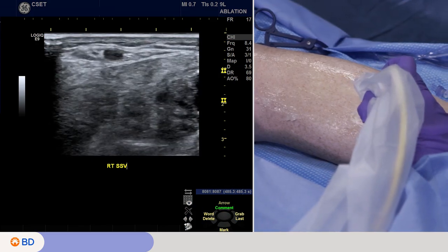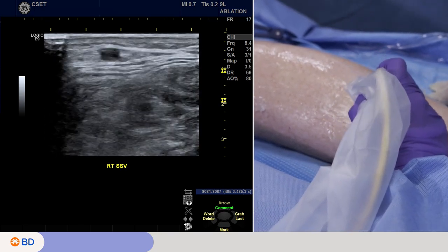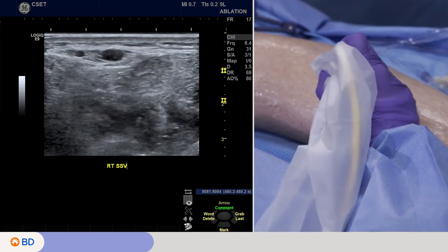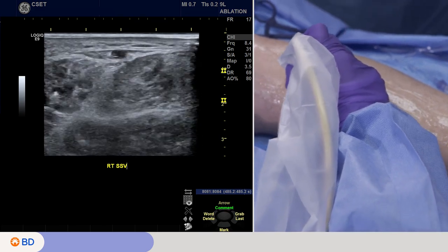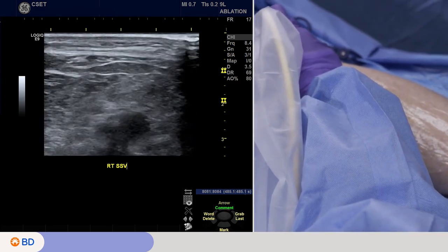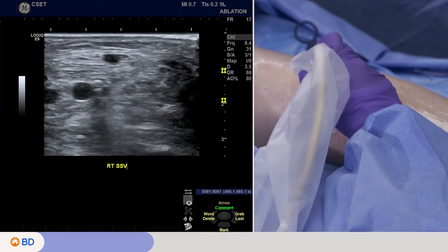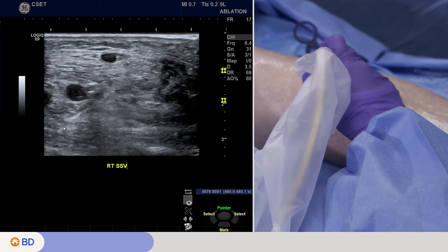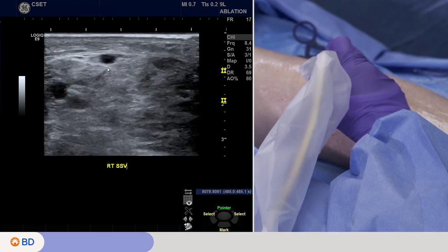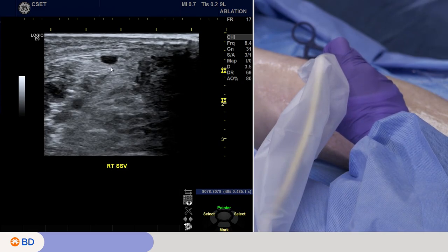One of the most important things we do after we prep a patient is tour through the anatomy with the ultrasound for several reasons: to identify the course of the vein and see if there are any anatomic variants, and also to see if there are any interval changes from our diagnostic ultrasound. As you can see, it's very straightforward — there's the small saphenous vein in the center of the screen, encompassed by fascia, the superficial and deep fascia. It has that classic Cleopatra's eye appearance that Casey's showing you. This is the small saphenous, and we also want to look for the deep veins.